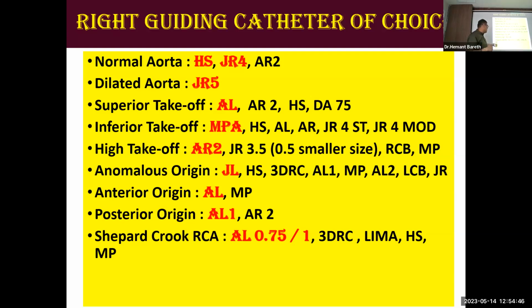Or hockey stick, or multipurpose if it is straight up or straight down. Vertical, always multipurpose is a good idea if others are not working. But the best is AL 0.75 or 1, or 3DRC is the safest.